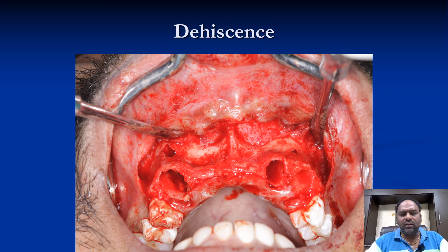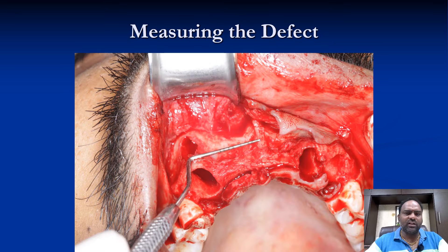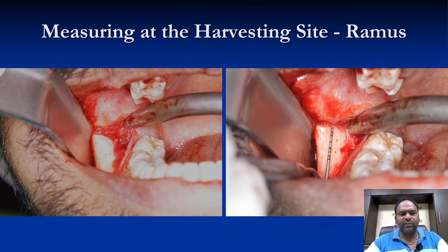There was dehiscence, fenestrations, and a cyst was also present on the root surface of the canine. Once extraction was done, this is how the area looked. We performed curettage with a serrated curette and with some round burs to remove any existing infection, and then we measured the defect.